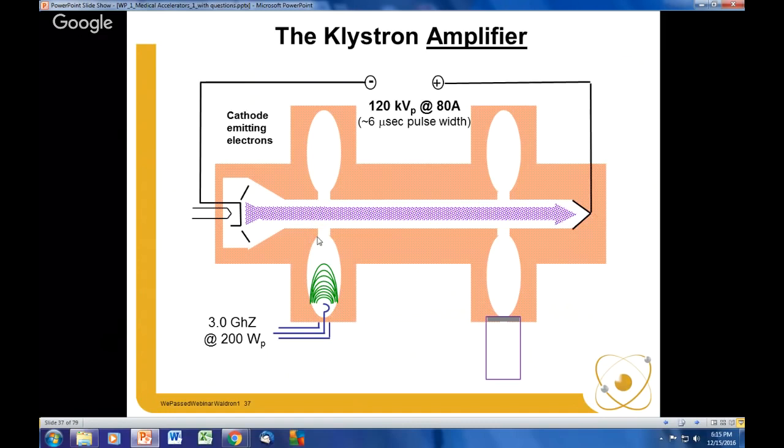This in turn is going to excite charges in the walls of this cavity, at a very thin depth, to begin to take on some of these characteristics. And what's going to happen is we're going to have an alternating electric field appear across this gap, and it will do so in a circularly symmetric way. This alternating electric field across this gap is going to modulate the velocity of this electron beam. We're going to have velocity modulation.